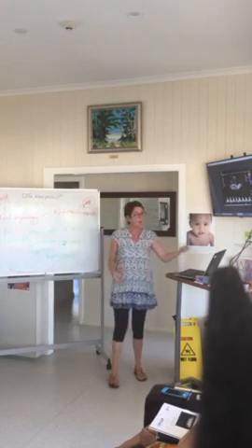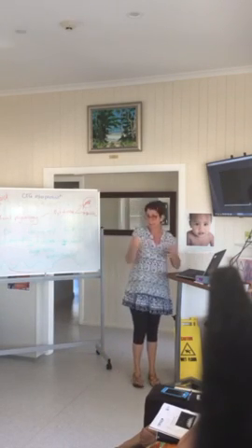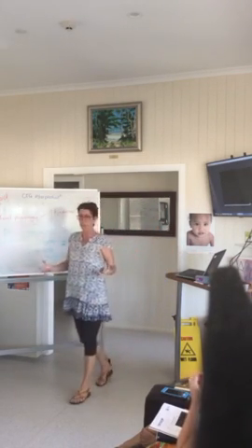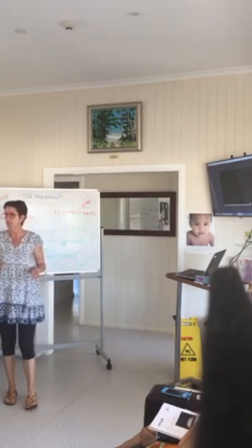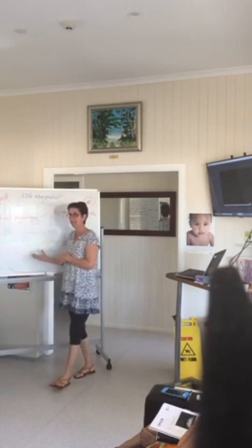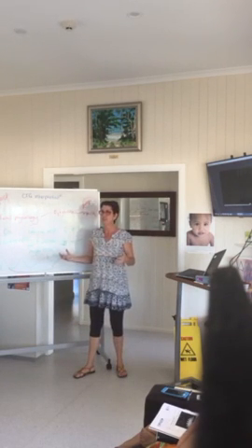Having Dopplers on a high risk is normal. Having AFIs on high risk is normal. Sitting down as a multidisciplinary team and interpreting it to work out what the woman's care plan is, isn't normal.